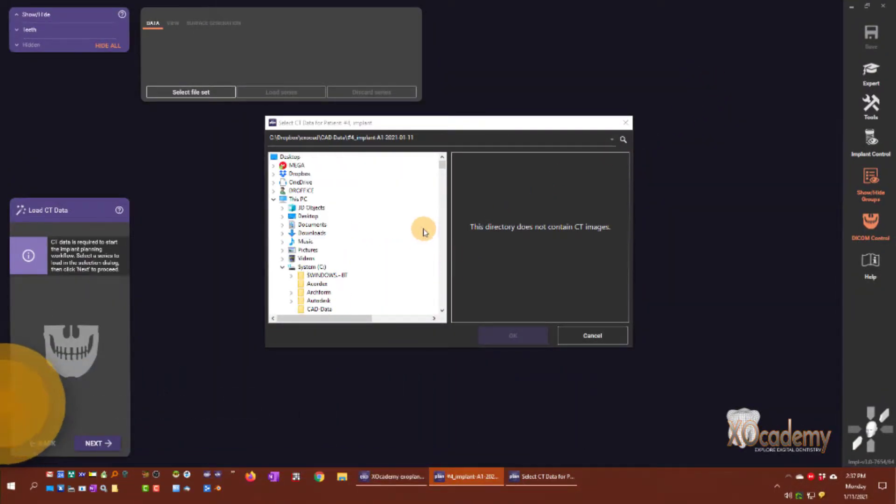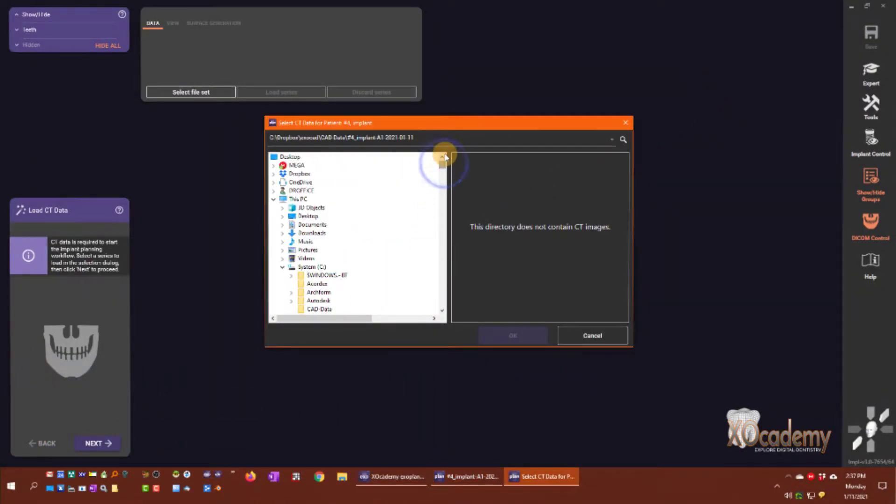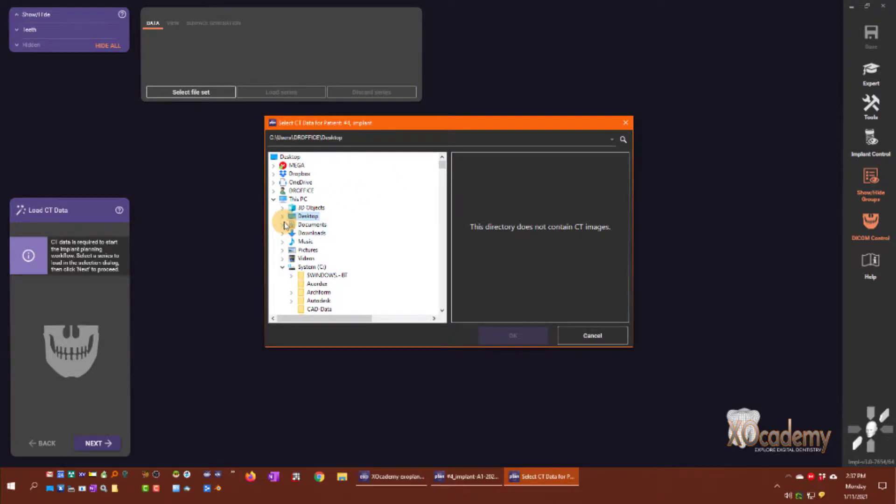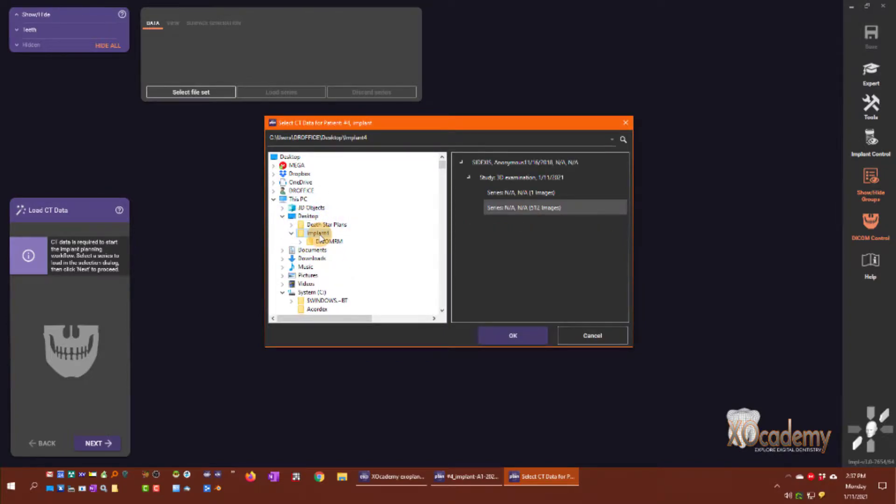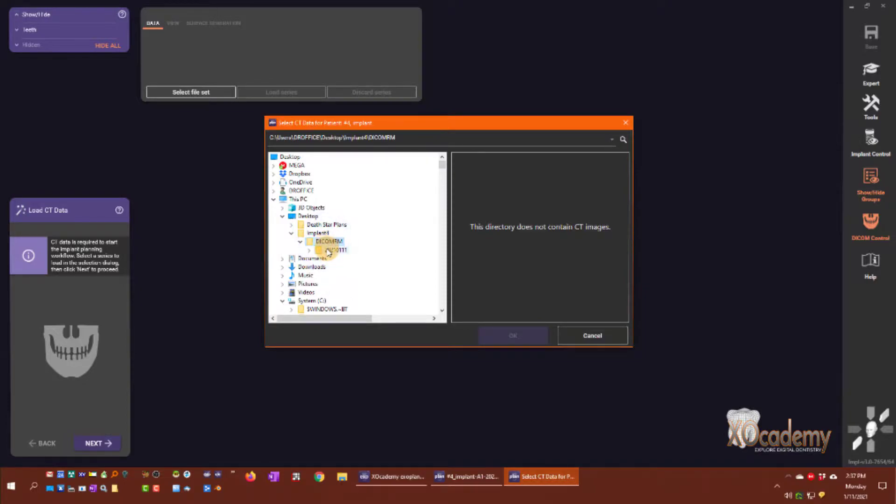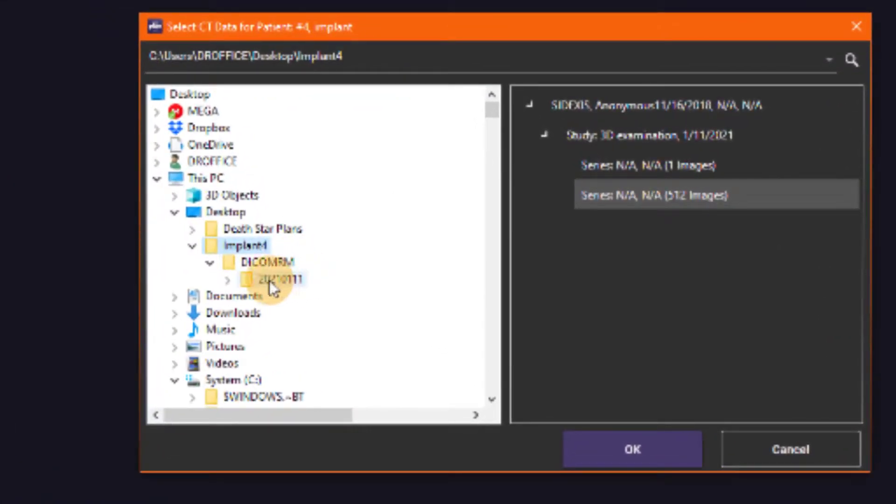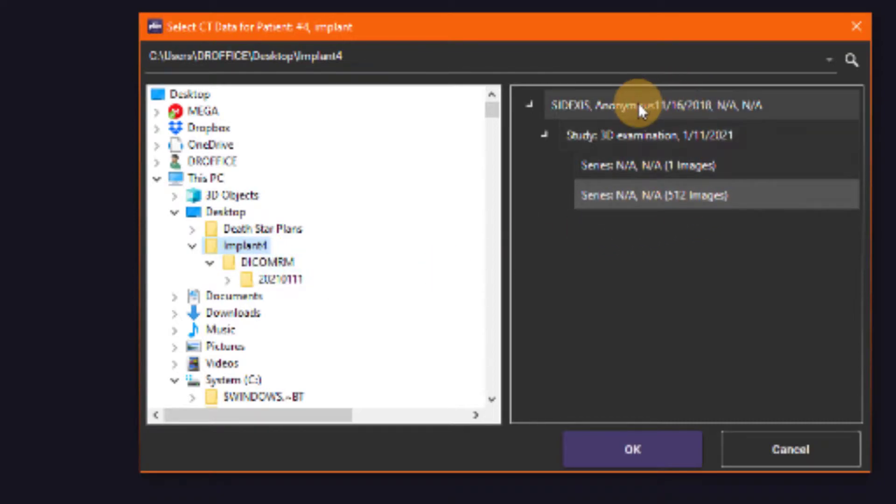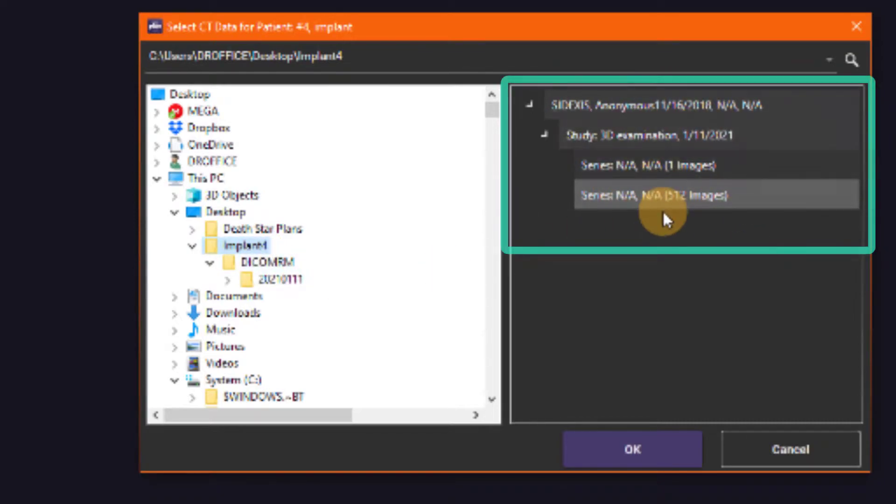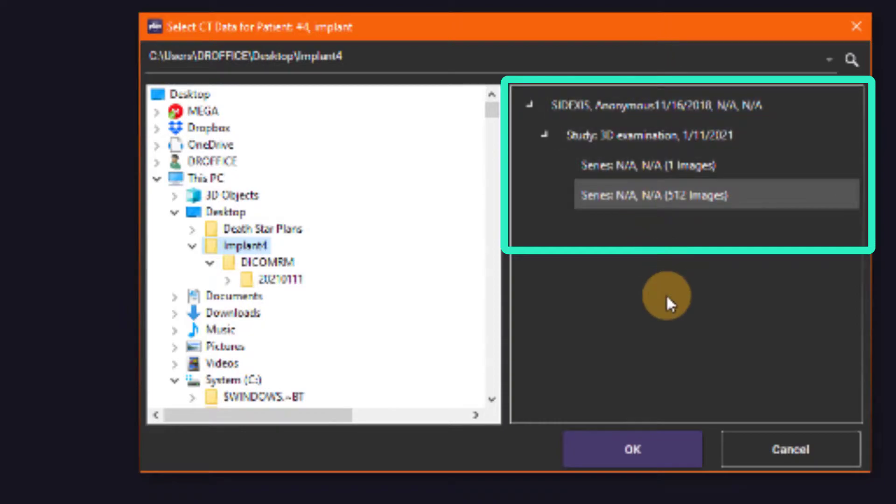The first step of our implant planning workflow is to select the CT data for our patient. Right here I have a desktop implant folder and then DICOM directory. This is one level above the DICOM RM directory. I select implant 4 and Exocad on the right side window chooses the series of images.